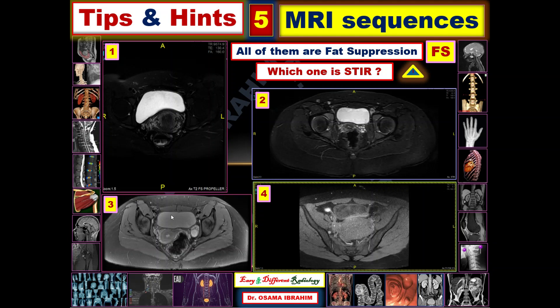If you look closely at all the images, you can check the urinary bladder first, which represents water. In T2 sequence, water appears bright. In this image it is also slightly bright, however in this image only the water appears dark. T1-weighted image is the sequence where water shows dark or low signal. Subcutaneous fat also appears dark, so this is a T1 fat suppression sequence.